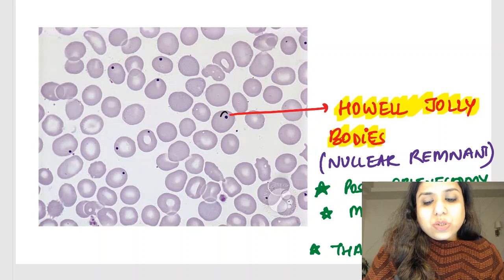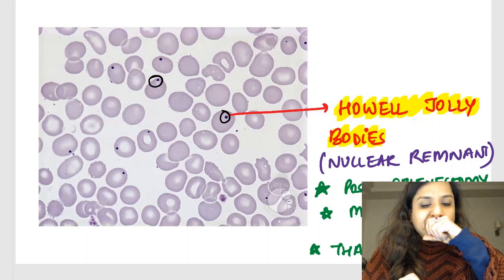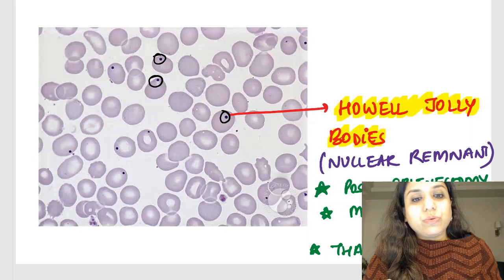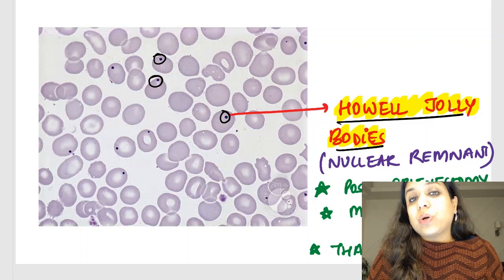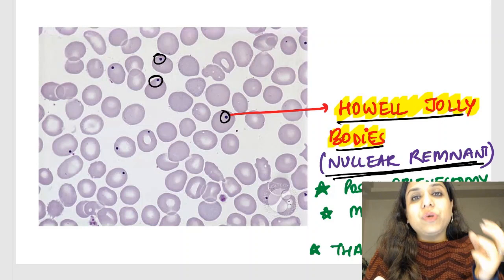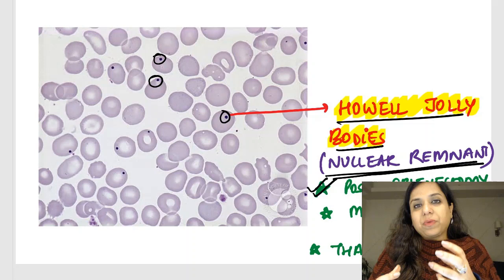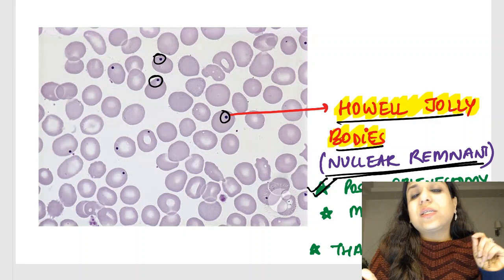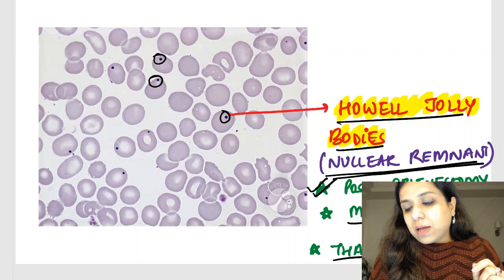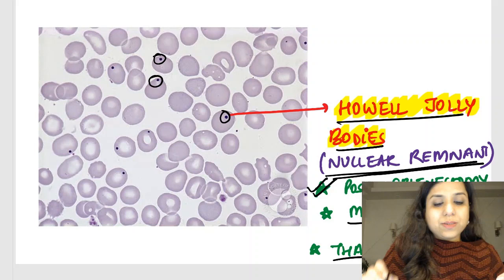This is an RBC with a bluish inclusion. These bodies which are seen are called Howell-Jolly bodies, and these are nuclear remnants — remnants of the nucleus. They are usually seen post-splenectomy: if you take out the spleen of a patient, you see these remnants of nucleus in the RBCs. They are also seen in megaloblastic anemia and thalassemia.